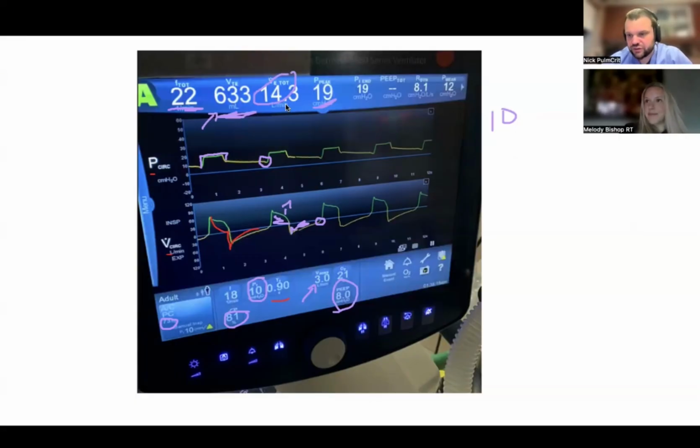Am I going to give them a liter and they're going to breathe 14 breaths per minute? I guess that's a start. That's a strategy I can do, but a liter is pretty big. Like that's a pretty big volume. So anyone looking at that's going to think that I'm completely insane if I do that. So you sort of have to be within the bounds of reason too, unfortunately, you know what I mean?